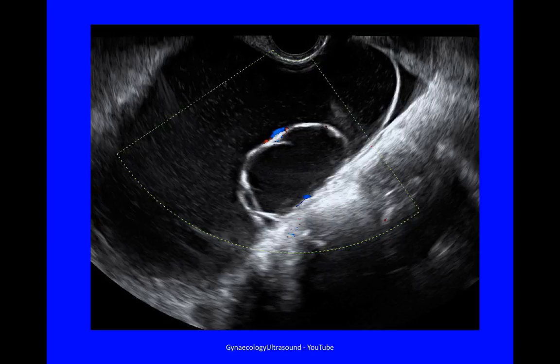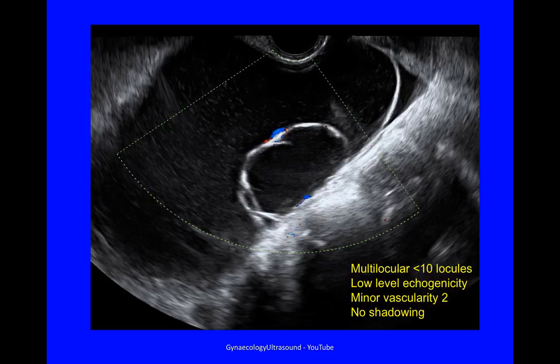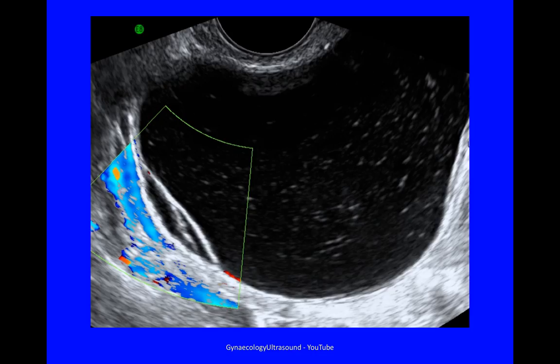Here are some examples. The first cyst was very large at 169 millimetres — multilocular with fewer than 10 locules, low level echogenicity, no solid material, minor vascularity with a score of 2, and no shadowing. The next example was 70 millimetres, again multilocular with fewer than 10 locules, no solid material, low level echogenicity, minor vascularity, and no shadowing. The third cyst was 67 millimetres — multilocular with fewer than 10 locules, no solid material, low level echogenicity with little dots visible in the cyst contents, minor vascularity just at the edge, and no shadowing.